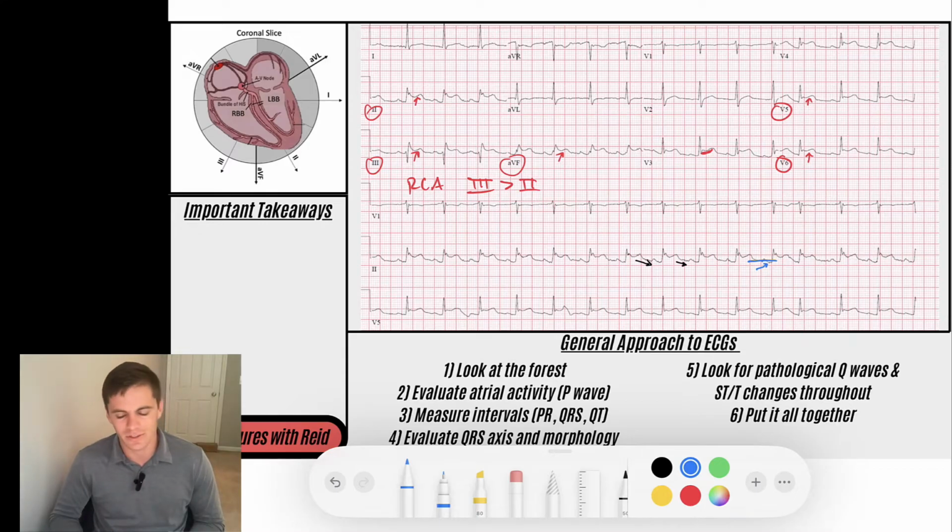Ultimately, like I said, a diagnosis of exclusion, and sometimes you do the ischemic workup. You get the troponin labs, the cardiac enzymes. You do serial ECGs. You treat with, in this case, an anti-inflammatory, or you treat the underlying cause. If it's a malignancy or autoimmune condition, you want to treat that cause of inflammation. But a lot of times these are diagnoses of exclusion, so very difficult.